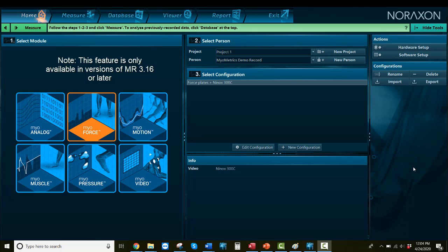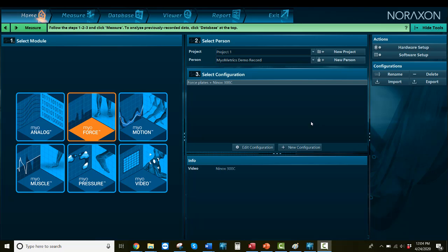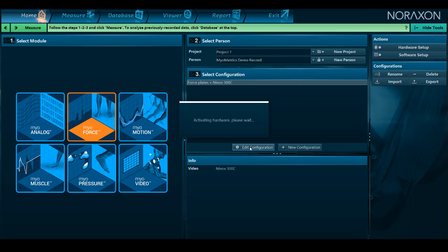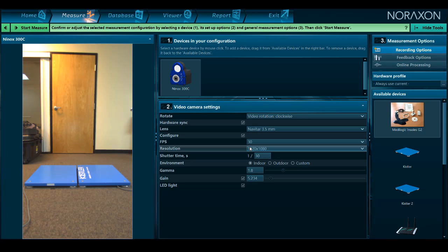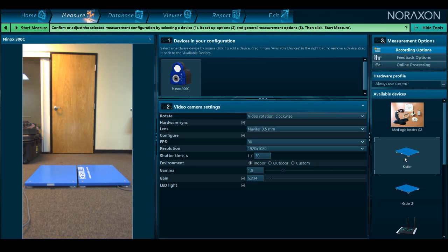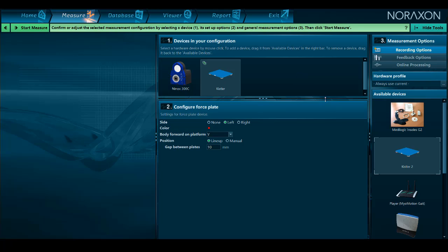We will start in the configuration for our force plates setup. You'll need to configure the force plate for a side, if using more than one, and a direction based on where the subject is facing relative to the plate origin.